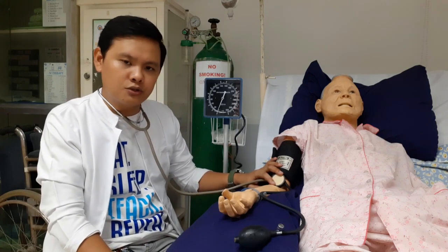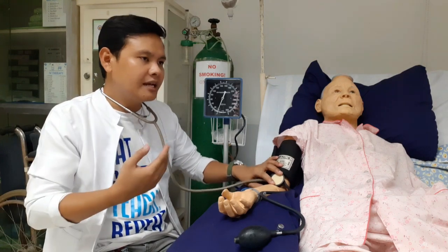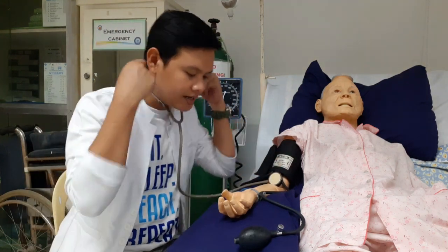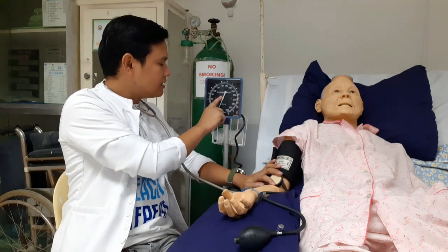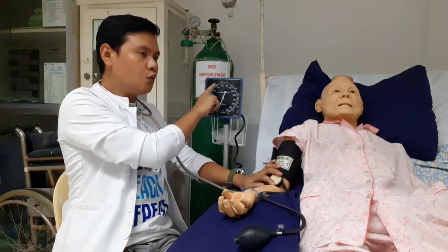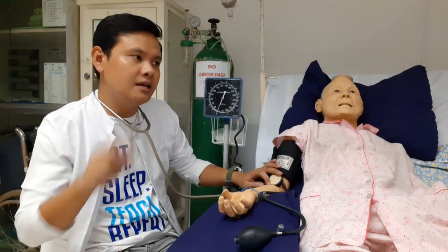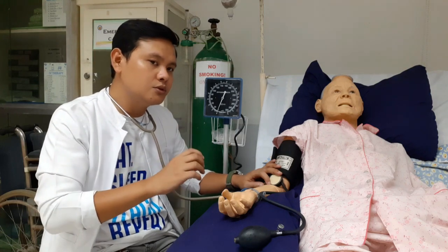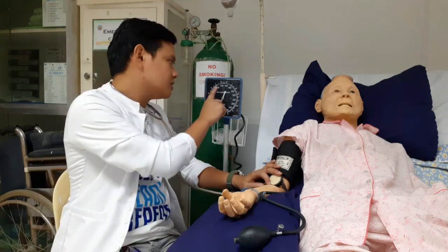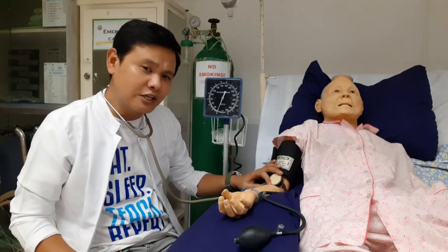First, you have to get the systolic. Sabi natin kanina, 120 ang systolic. Kaya upon checking here, narinig ko kanina, okay, itong dial ay umabot hanggang 130. Doon ko narinig yung malakas na sound. Okay? Narinig ko kanina, tugs, tugs, tugs. Yung malakas na sound ay tumama doon sa may 130. Ibig sabihin, ang systolic ng pasyente ko is 130.